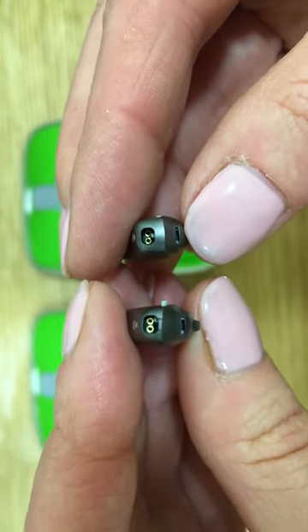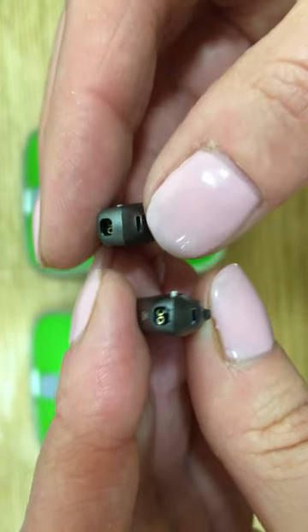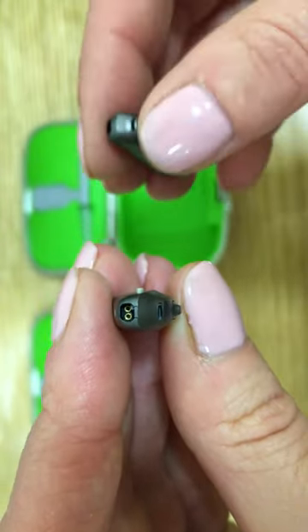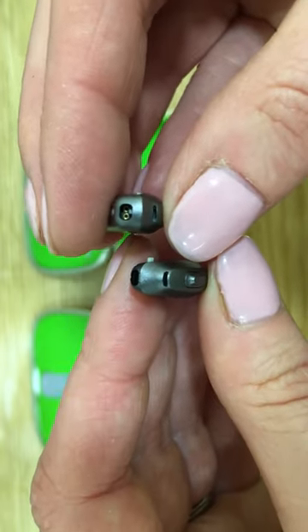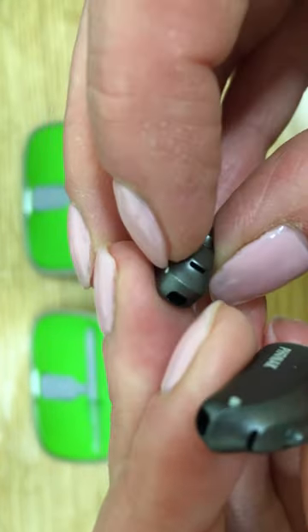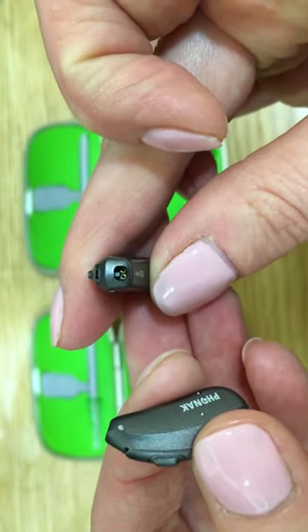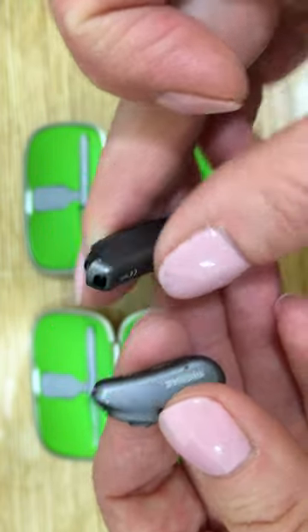What we can see here — on the left instrument, the little pin is in the out position, which means we should easily plug the receiver in. Once the receiver has been plugged in, this pin is pushed into place, which locks the receiver in. On the instrument here on the right, the pin has now slipped in, which means the lock is in the way. We will therefore be unable to insert the receiver until we have pushed the pin out.